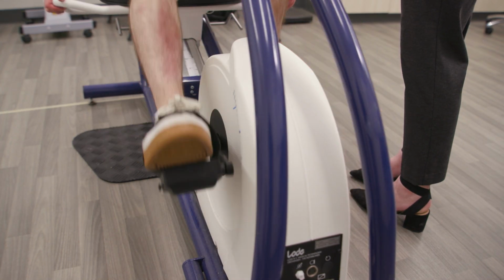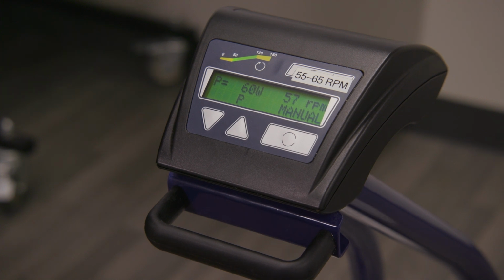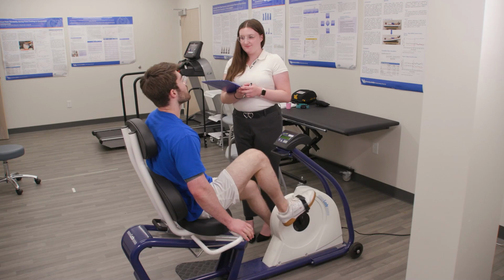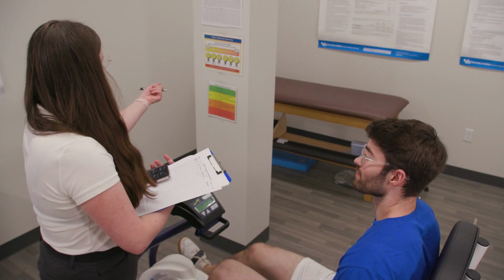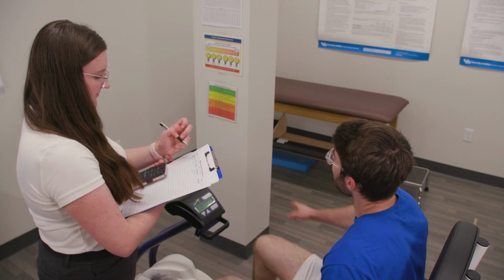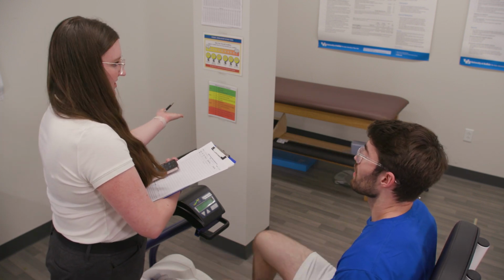The patient should pedal the bike between 55 to 65 RPMs. The patient must keep a relatively consistent pace throughout the test. Once the end of the first stage is close, ask the patient to rate their exertion and symptom severity on the RPE and VAS scales. Record their heart rate at the end of each stage.